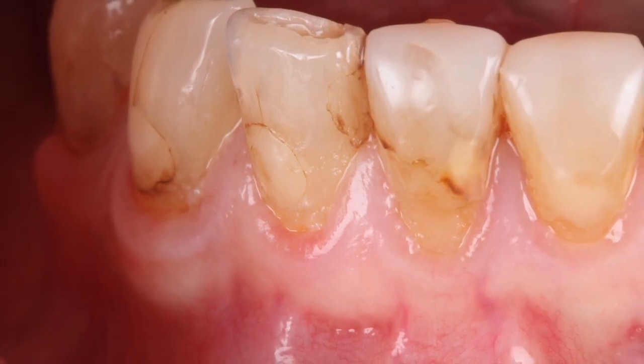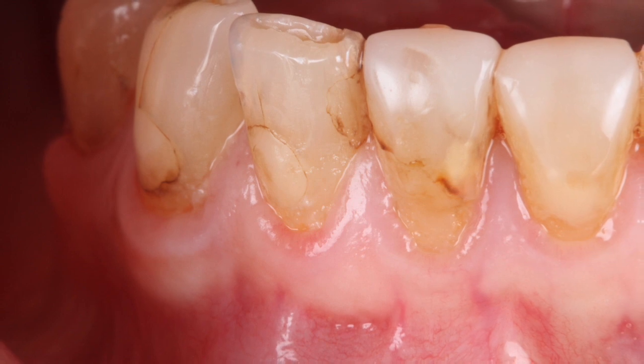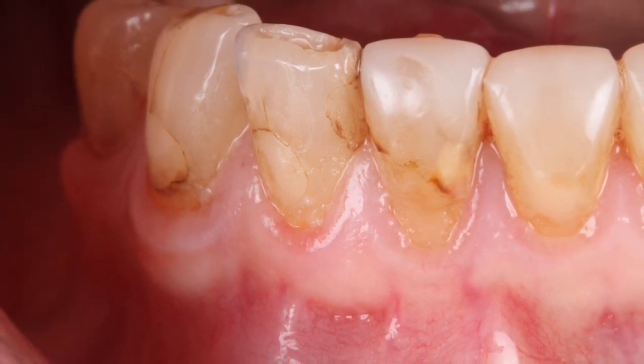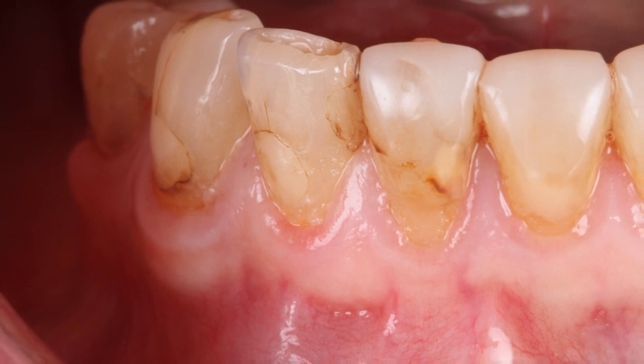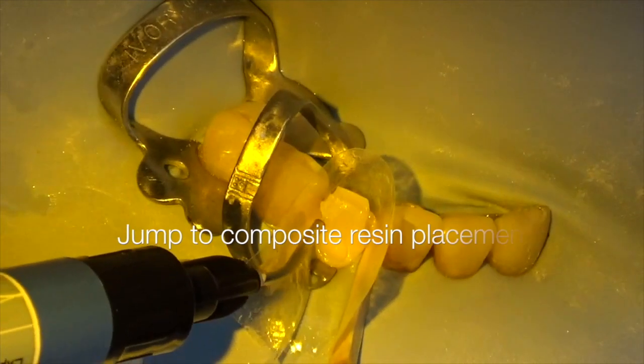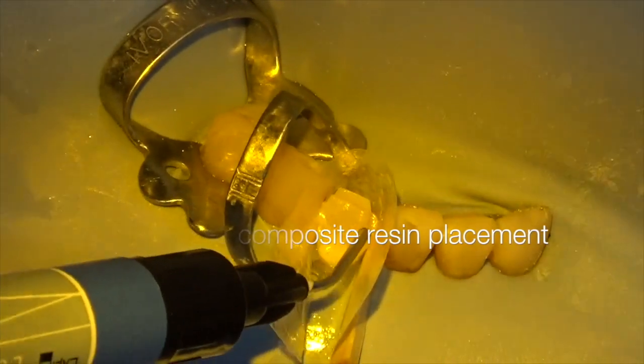This is a very simple case — the patient came in with sensitivity due to some chipping around the incisal edge. Not a fancy case, just a routine composite resin case.